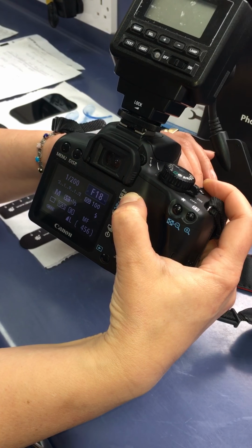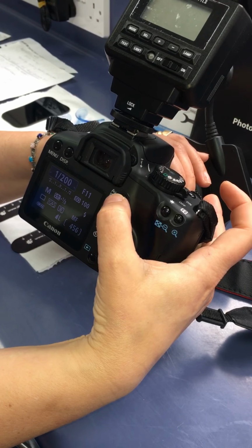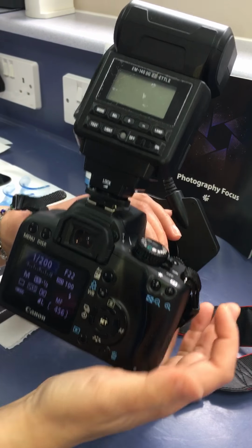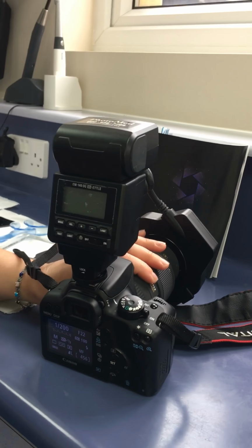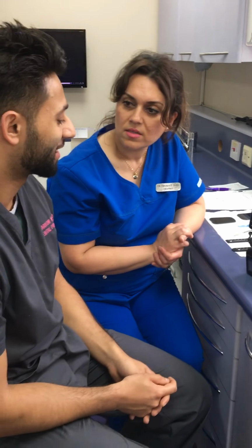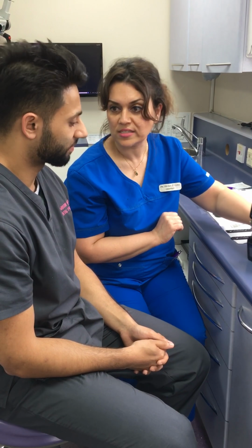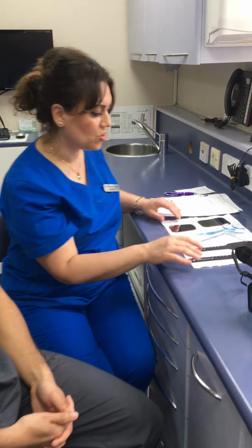For instance, if you're going to take a portrait, you'd want this to be on F11. But for now I want to keep it on F22, which is for what kind of photography in dentistry? Any smile, lateral views. What else? For the smile line, taking the occlusal views with the mirrors, and also maybe some contrast photos.